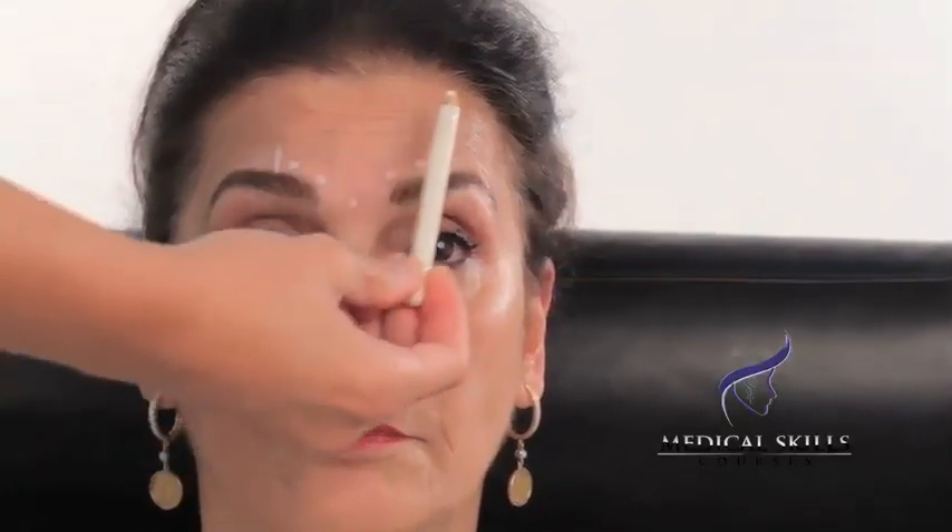For each area of the face, it's important to ask the patient to contract the muscles prior to marking so that you can assess where the wrinkles are forming and where the injections are required. If you'd like to raise your eyebrows — assessing the forehead and frontalis, we can see that the wrinkles are distributed fairly evenly across, going right up to the hairline. In females, we tend to inject in a V pattern. Frontalis runs this way and this way, so there is a triangular area in the centre that is deficient of muscle and does not require any injection.